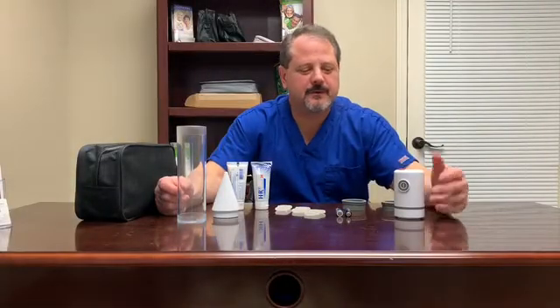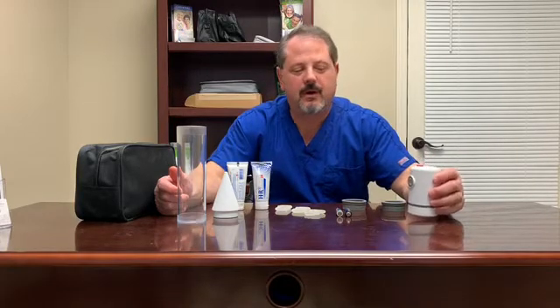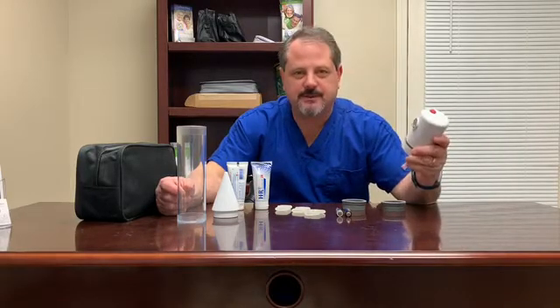Hi, this is Brent with Reach Medical. These are the components that come in the BOSS 2 kit, the original kit that you purchase. There are additional accessories you can buy that we'll show you about later.